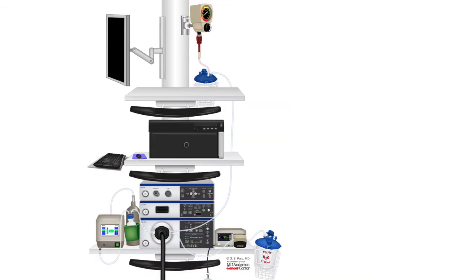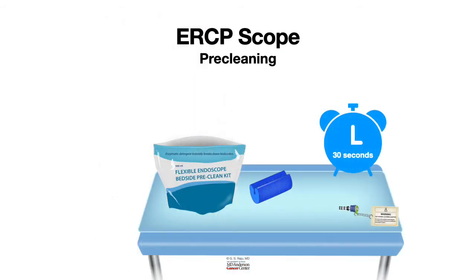After the procedure, immediately after the ERCP scope comes out, it's important to do the pre-cleaning. Do not wait. Do it immediately. And as part of that, we turn off the light, and then the setup is there for pre-cleaning. It requires an enzymatic detergent, a sponge, an air water adapter, and a stop clock.